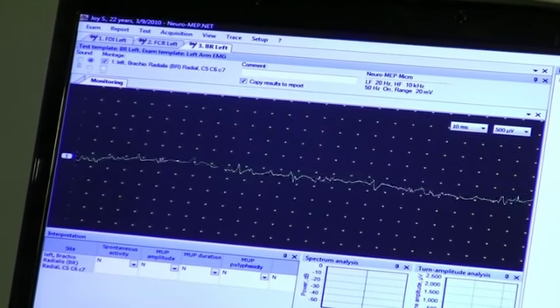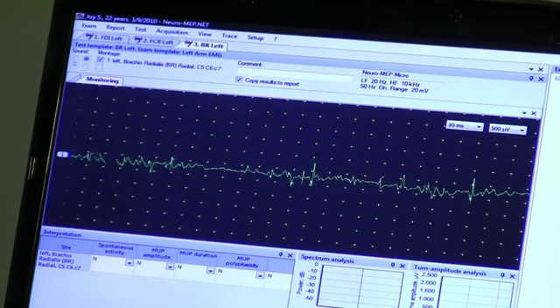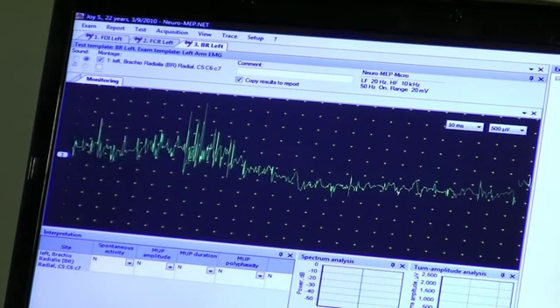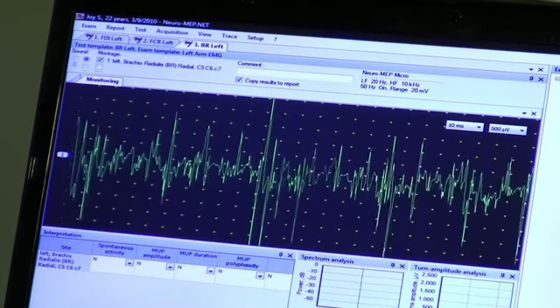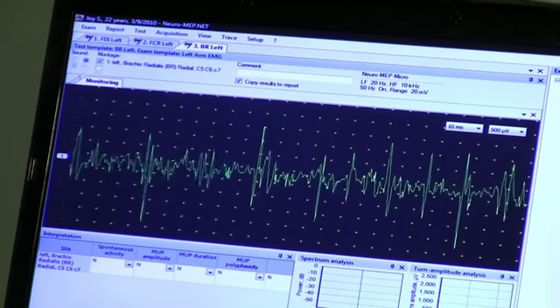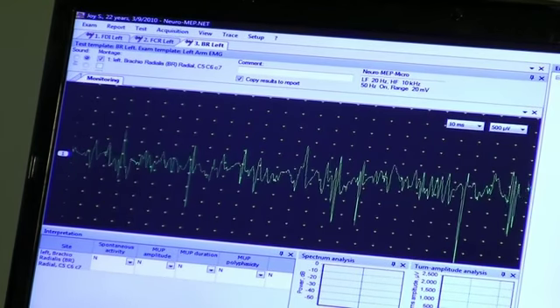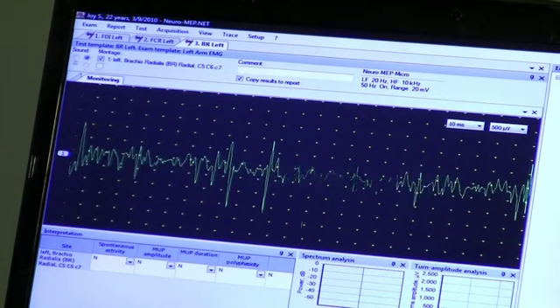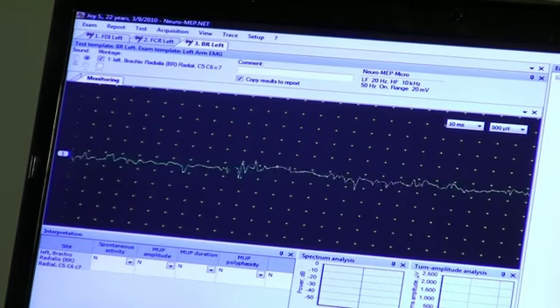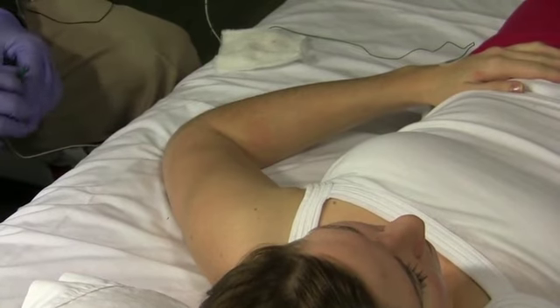And here you see motor units. Raise up some more. You see more motor units all the way. And these motor units look perfectly normal. They're what we call mono or biphasic motor units. That means they do not indicate re-innervation, and that means the muscle is fully innervated. Now relax. I take it out. The next muscle is the triceps.